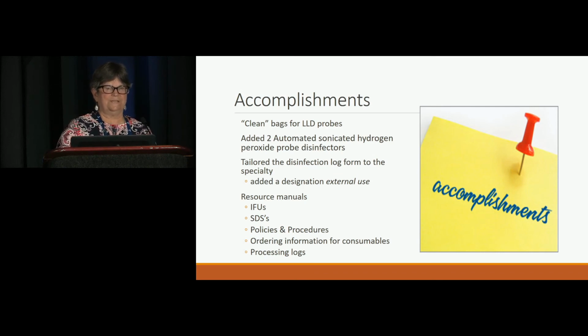And where we got into this is we started in the endovascular OR. Of course, at the end of the cases, everything in the room is wiped down, including the surface probes that are sitting there; they should be wiped down.